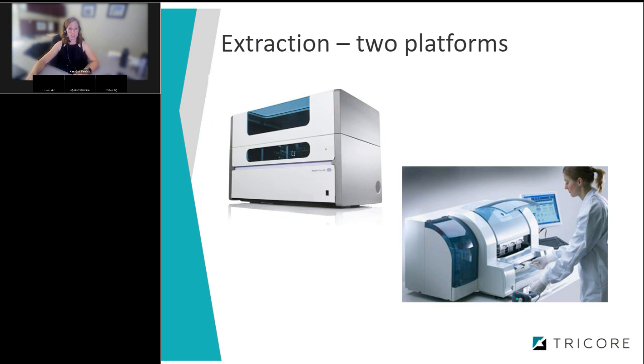The EasyMag was the first platform that we brought on. This platform's fairly nice, except that you have to come back 10 minutes into your extraction and add magnetic beads to all of the samples. So it kind of doesn't give you as much downtime in between loading the instrument and unloading the extracts. You also are limited to 24 samples at a time, and I believe this instrument is being sunsetted by bioMérieux.